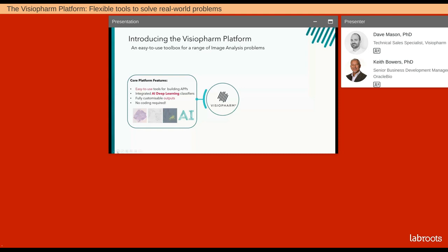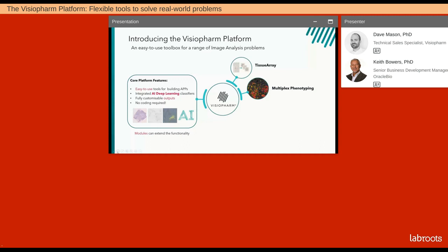The core platform features sometimes need to be extended, and this is where we introduce modules — additional processing units that can be added onto the core VisioPharm tools to assist in image analysis workflows. The four modules I'd like to introduce are Tissue Array, Multiplex Phenotyping, Tissue Align, and Brain Mapping. During the rest of the first half of this talk, I'll be touching on each one of these core tools and modules in a little more detail.